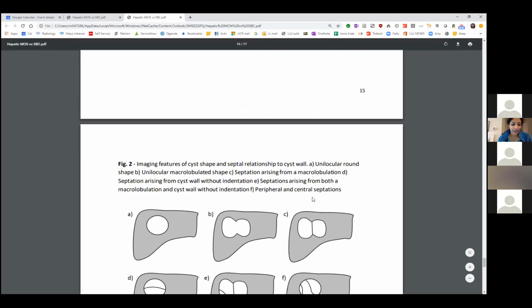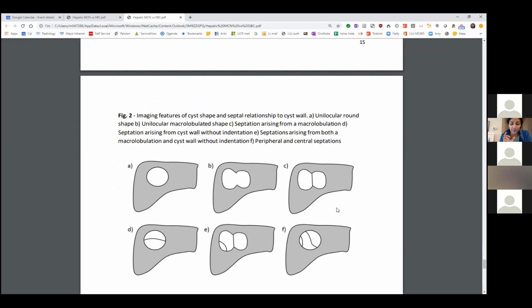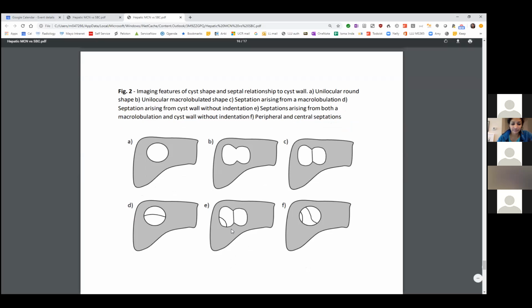Cool. Actually, Nellie, that picture reminds me of how I explain pancreatic MCNs versus serous, because the MCNs have a capsule. They will have that very solid rim, so it'll be round or ovoid, whereas the serous has this lobulated edge, because the capsule won't be lobulated like that. That's a really great point, and that's exactly what they described with biliary mucinous cystadenoma versus just a simple cyst.